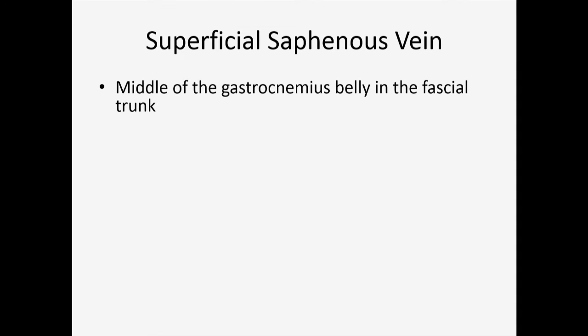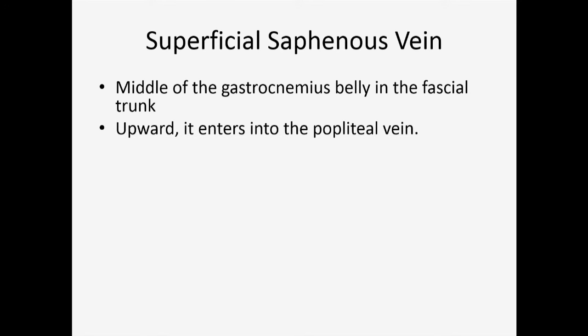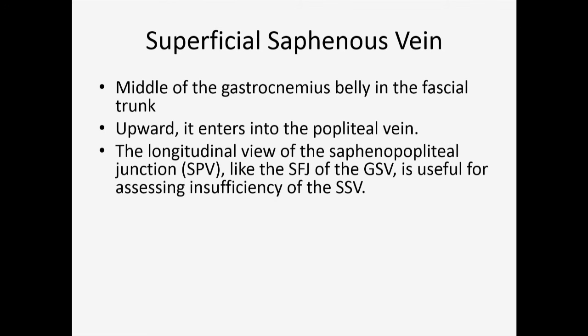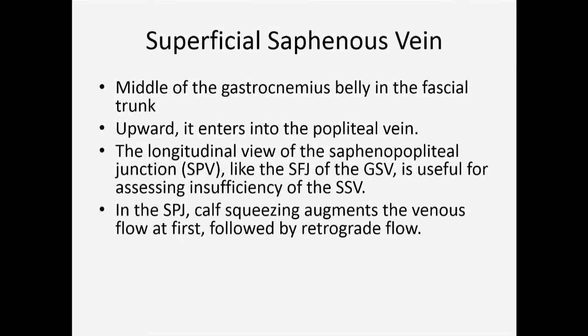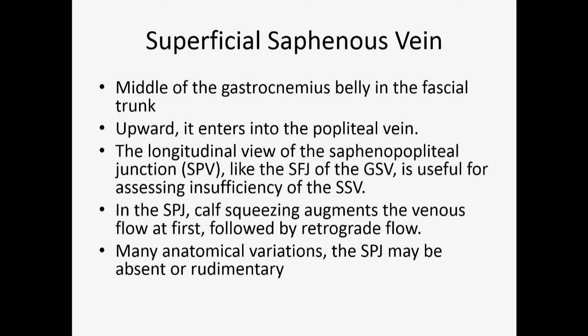The small saphenous vein is at the middle of the gastrocnemius belly in the fascial trunk, going upward and entering the popliteal vein. We start from proximal to distal evaluation of the small saphenous vein at the saphenopopliteal junction to assess for insufficiency. At the saphenopopliteal junction, calf squeezing with the blood pressure cuff augments venous flow first, followed by retrograde flow. There are many anatomic variations in the distal part of the small saphenous vein, and the saphenopopliteal junction may not always be present.